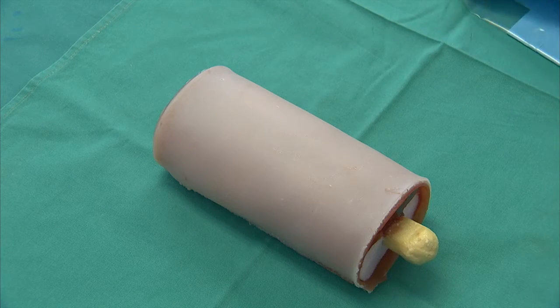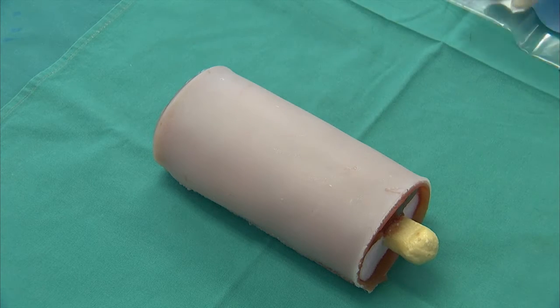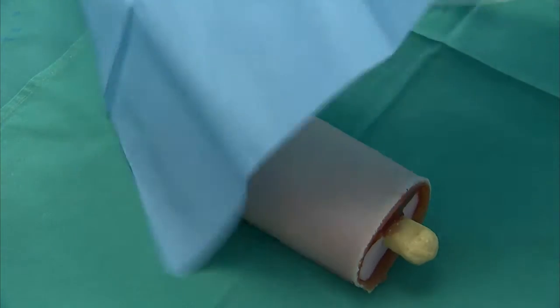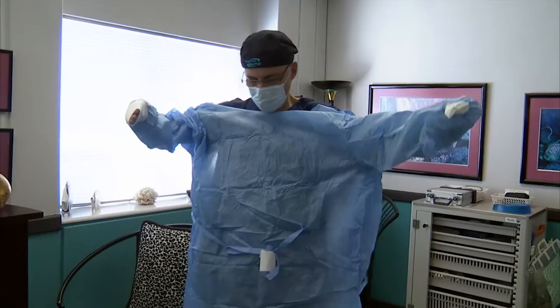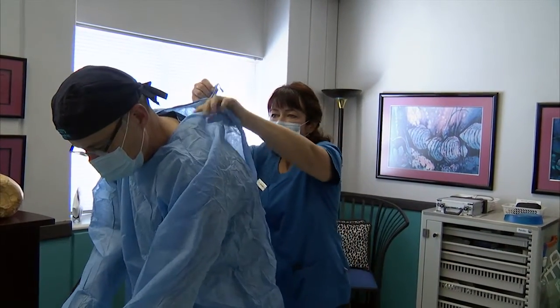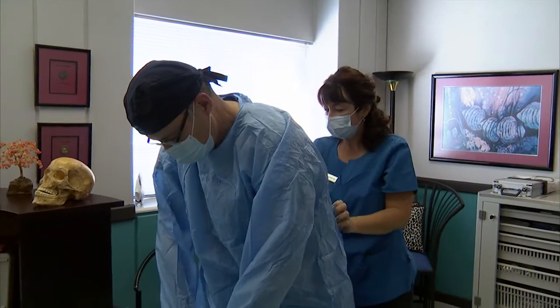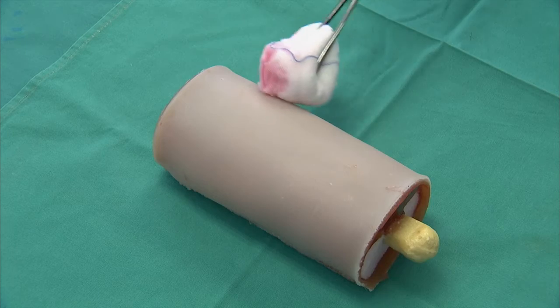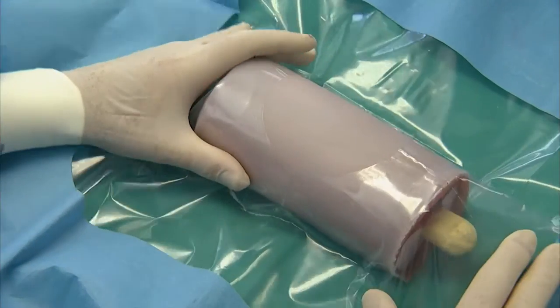Open a work surface cover on a suitable work surface, representing the patient on a clean sheet on the operating table in the OT. The operator and the assistant prepare their hands hygienically and then gown and glove according to protocol. The Apprentice Doctor for Future Doctors course thoroughly covers all the basics on sterility and asepsis and related protocols. The operative site is first cleaned with a suitable antiseptic solution and then isolated with a surgical drape.